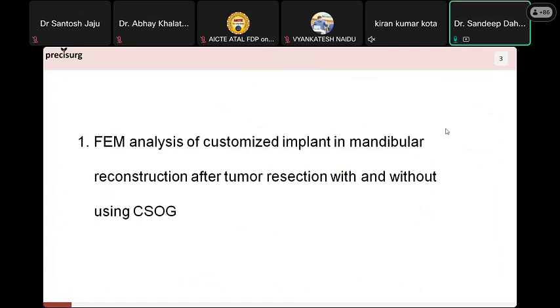The distance from the lesser trochanter to the center of the femur head is called the vertical offset, and the line from this center to the vertical axis of the bone is called the horizontal offset. So these three parameters are important in the hip implant: neck shaft angle, vertical offset and horizontal offset. These three parameters vary from person to person.